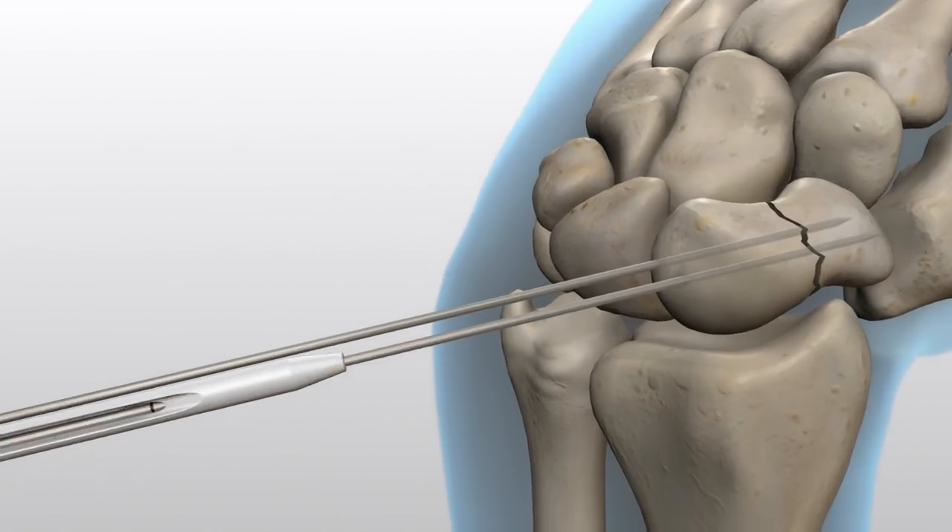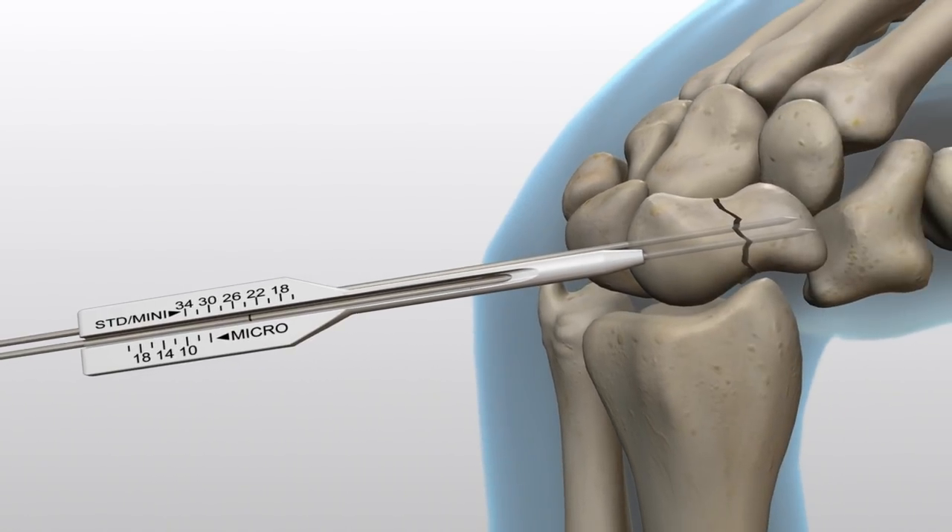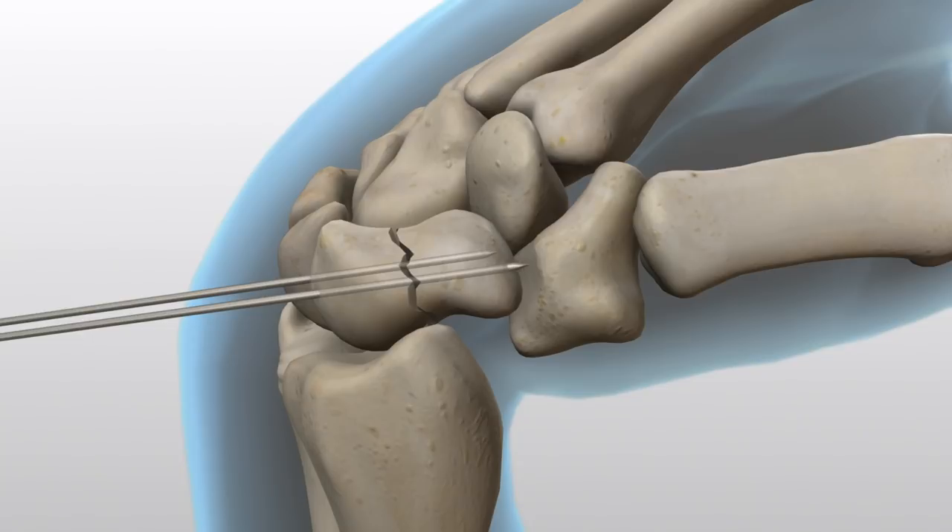Measure the wire depth with the side marked Standard and Mini on a percutaneous screw sizer. This measurement is the total length of the scaphoid. The screw length should be 4 millimeters shorter than the total length of the scaphoid. Before inserting the screw, advance the guide wire through the far cortex.